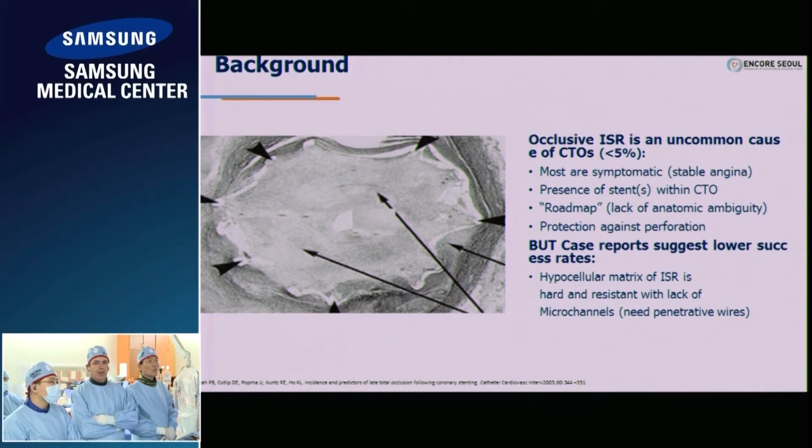This is just a little background about the approach with ISR and really why cross-boss, I think, works in this situation.